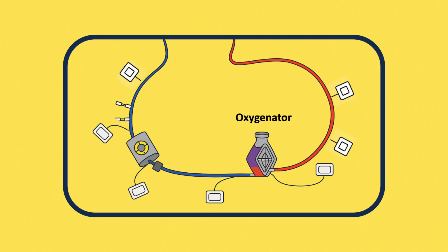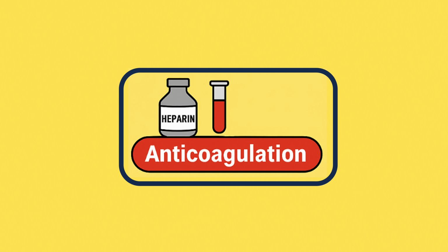The oxygenator may also contain a heat pump to control the temperature of the blood. This is followed by a post-oxygenator pressure sensor used to calculate the pressure across the oxygenator, which is an indicator of the oxygenator health. This could be followed by an arterial saturation monitor and finally a flow sensor and then the inflow cannula.